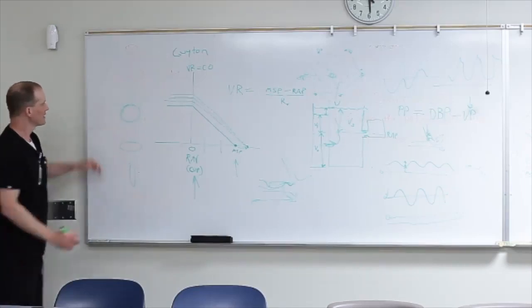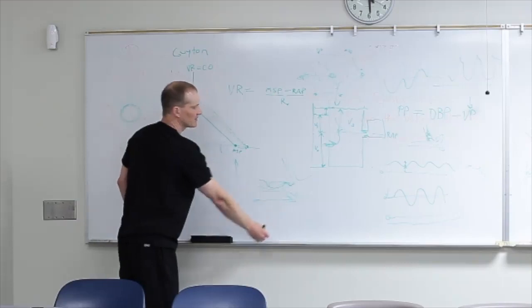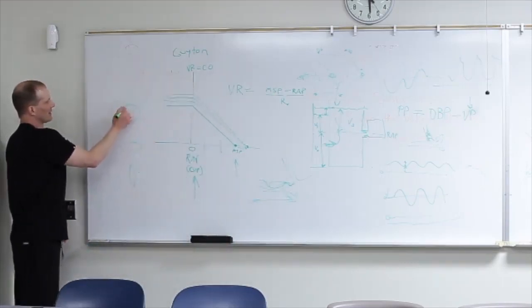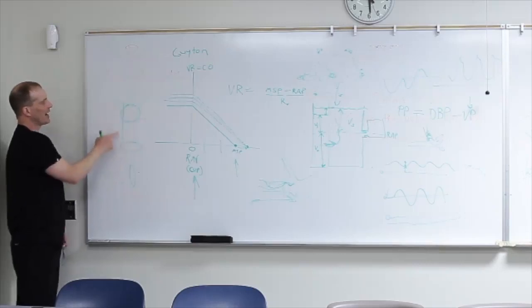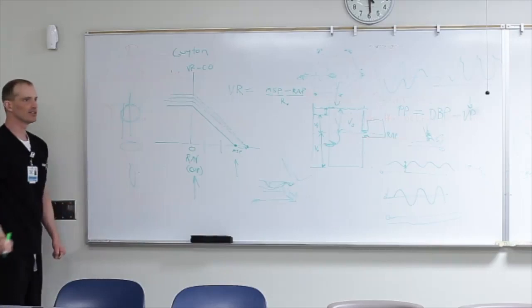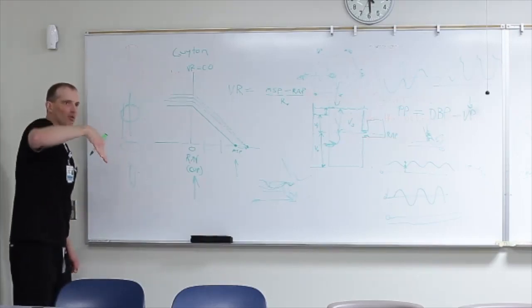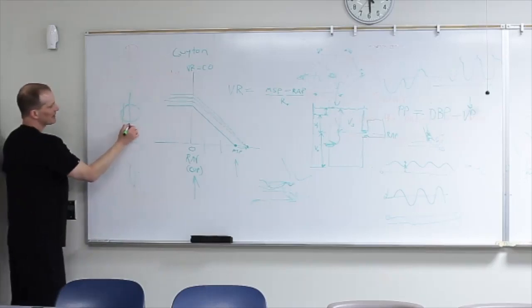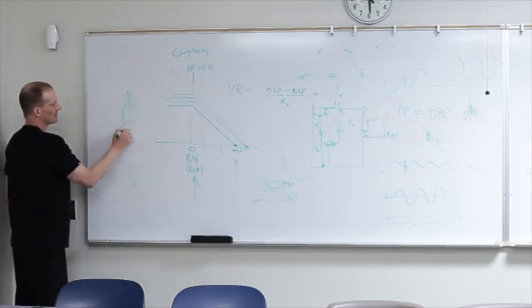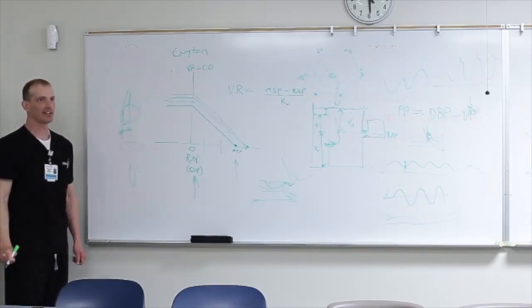And the other thing is that if you drop your M-mode beam and you happen to be dropping it here, the IVC is going to look smaller than if you dropped it here. And by accidentally fanning back and forth and not holding your hand steady, you're fanning it here, then back to here, and making fake collapsibility, right?